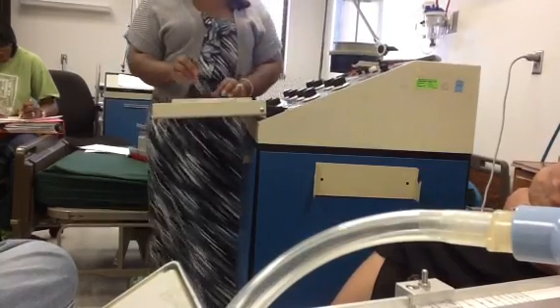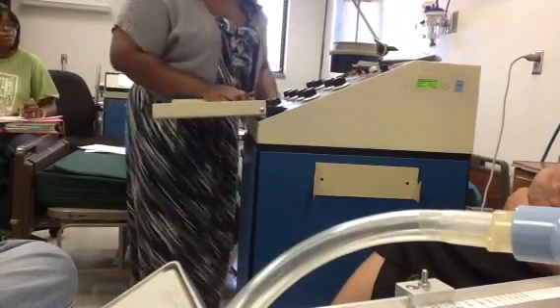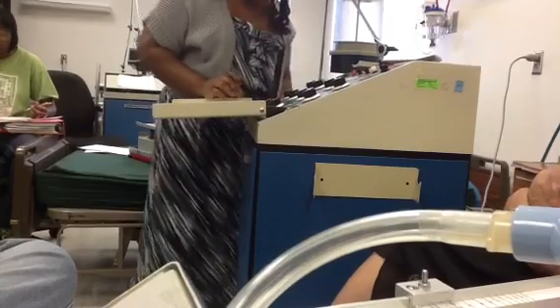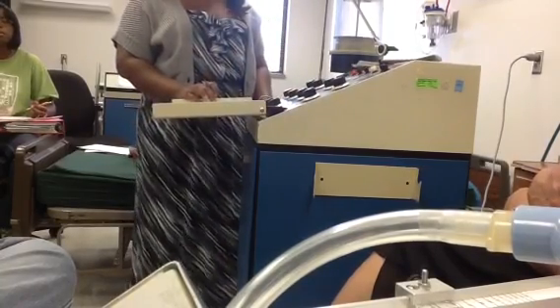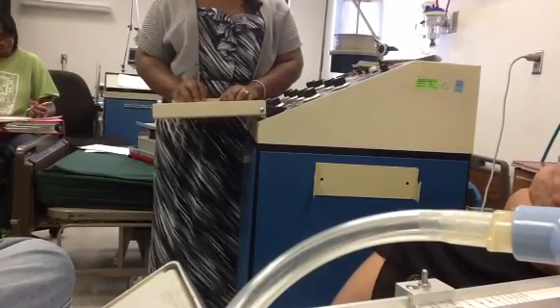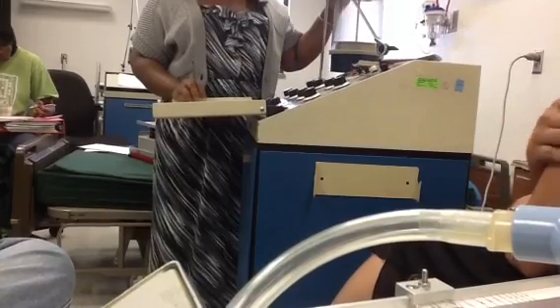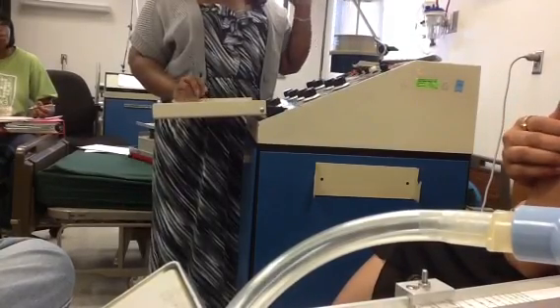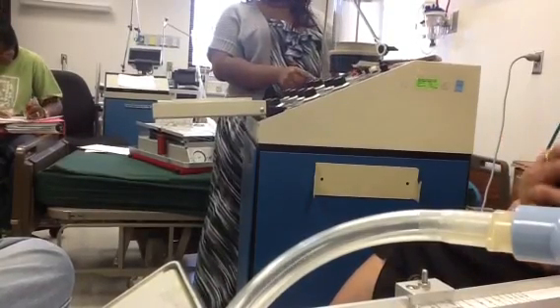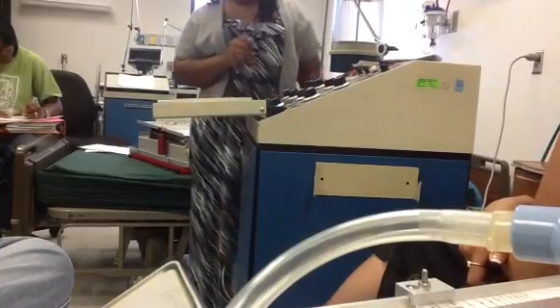Peak. So that's why we put in percent, not decimal. It'd be 0.80. For charting, we put it in percent or decimal? Doesn't matter. Peak would be what you said, and you need to check and make sure it's right. So remember, watch to see where the needle falls back to. It should be what you were ordered to set, which was 7.